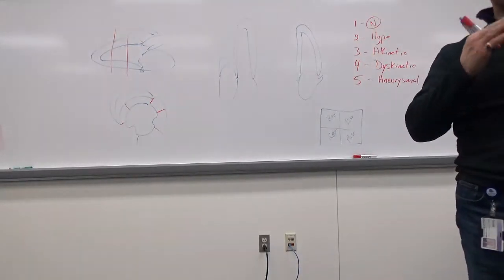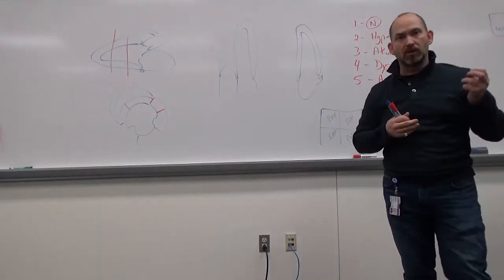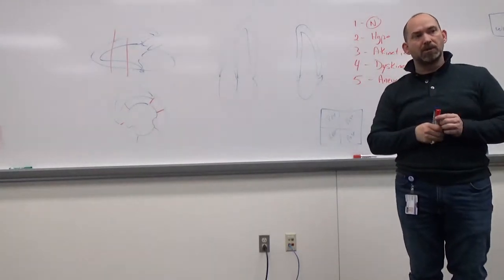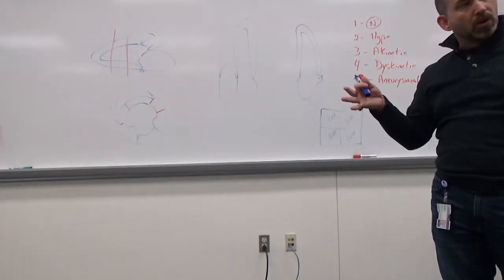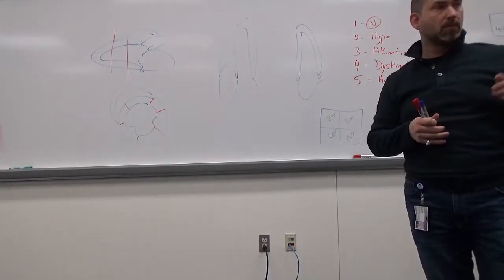Just like looking past a really stenotic carotid artery, if I've got a big stenosis in it, if I'm more than 2 centimeters beyond that, my velocities can be back to normal, and we missed the disease. So in stress echo, same thing. If my time window has gone by too far, your exam is useless.